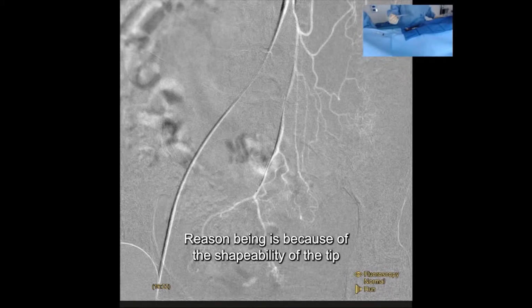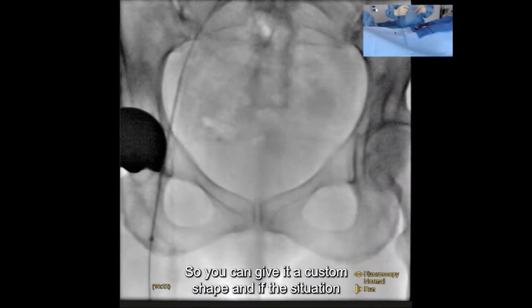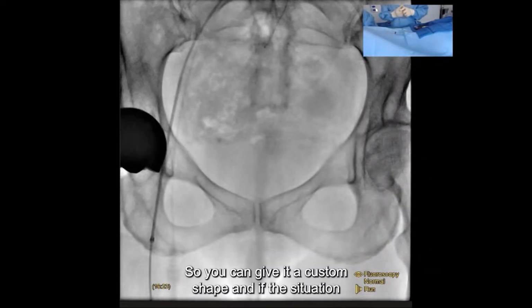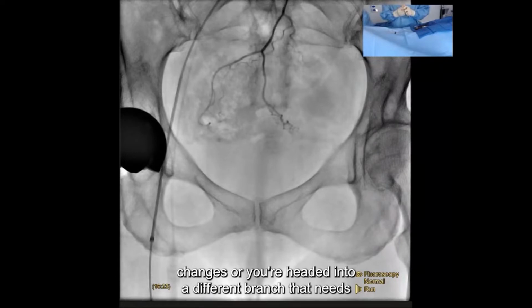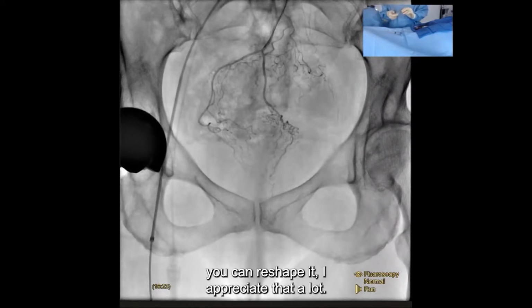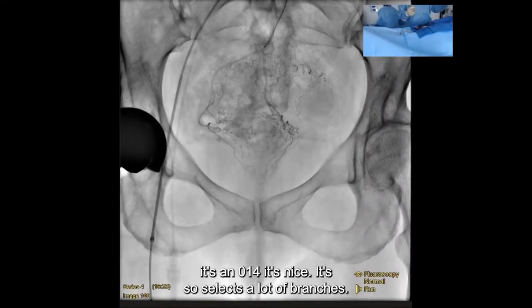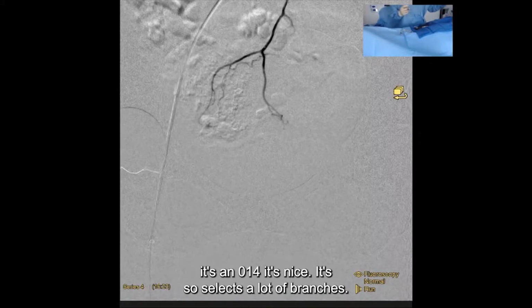Reason being is because of the shapeability of the tip and the ability to reshape it. So you can give it a custom shape, and if the situation changes or you're headed into a different branch that needs a different shape on the tip of the wire, you can reshape it. Right. I appreciate that a lot. And then it's just an 014, it's nice, it selects a lot of branches.